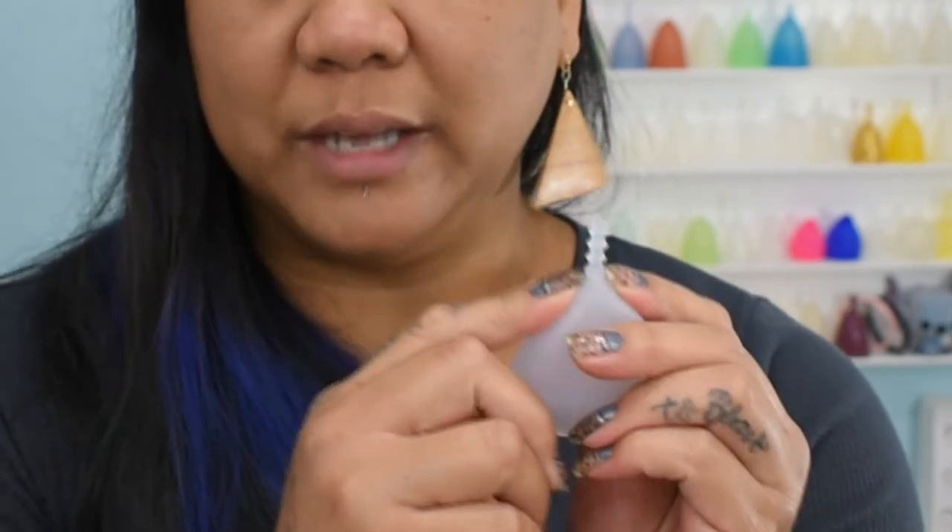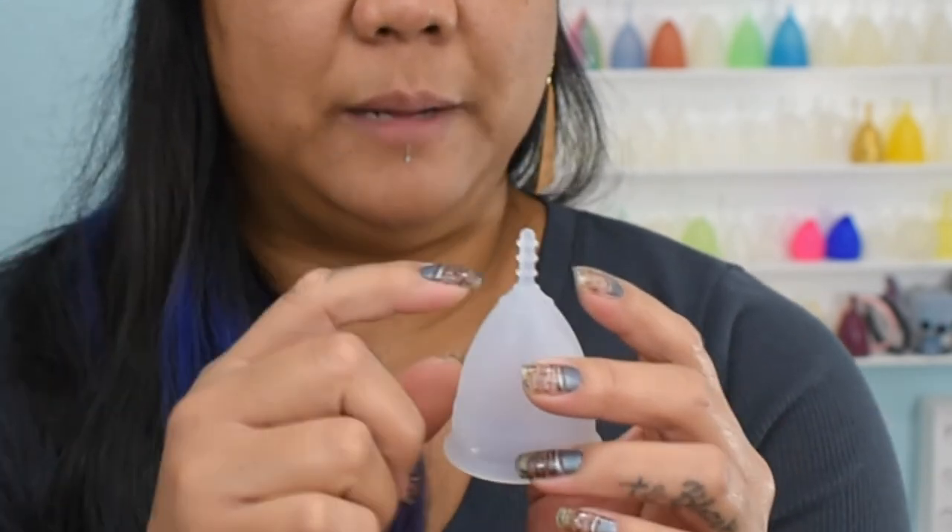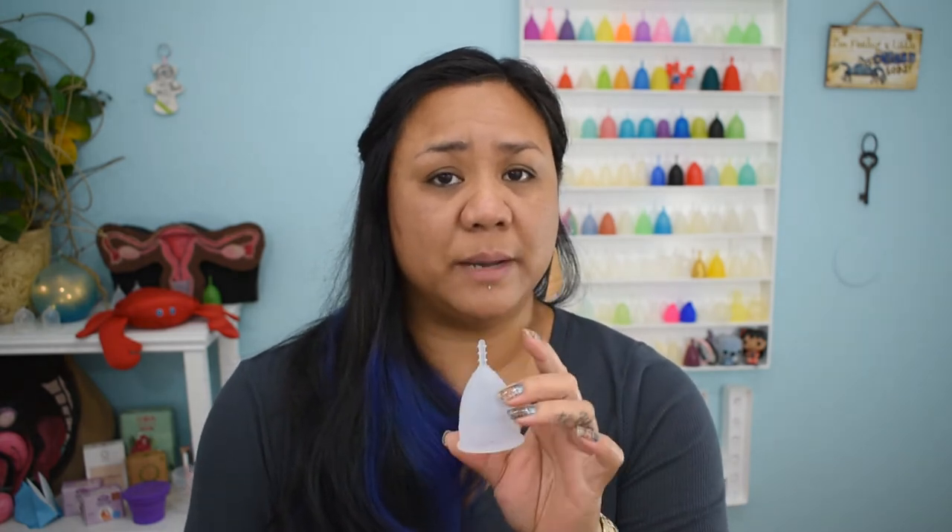My cervix is normally medium to high, and just the way this cup sat, the stem was at the opening of my vagina, and sometimes the friction between my labia while I moved around was quite irritating. So if I were to use this cup on a regular basis I would probably trim the stem off. A note for trimming the stem: make sure to leave a little bit of stem intact because there's just a thin piece of silicone — you don't want to cut into the actual body of the cup and make it useless.